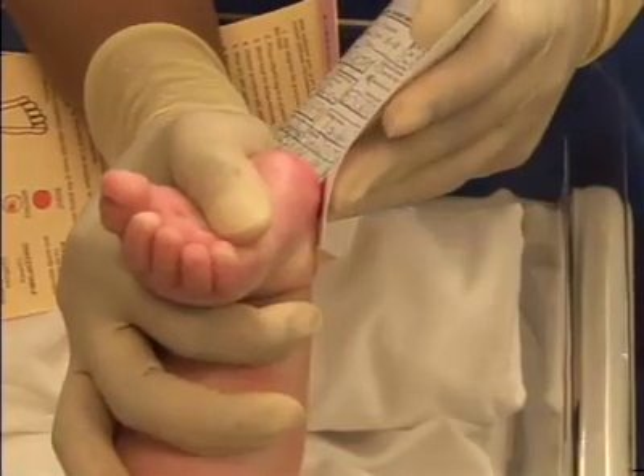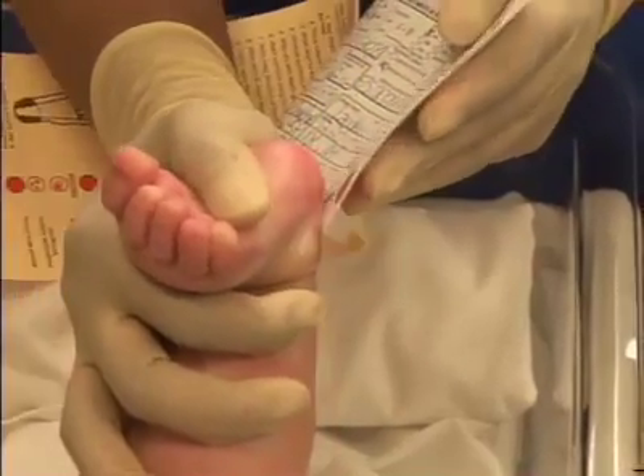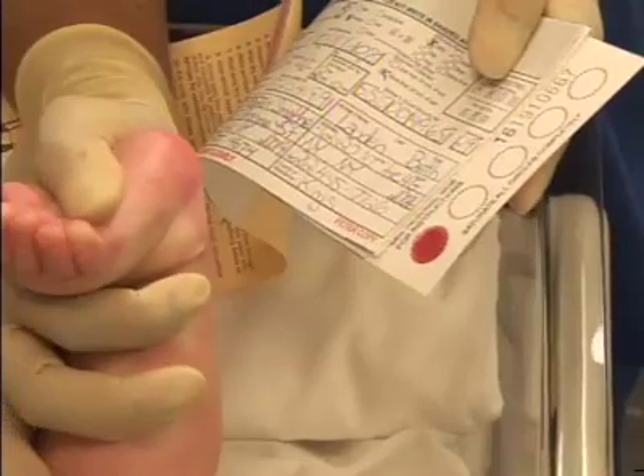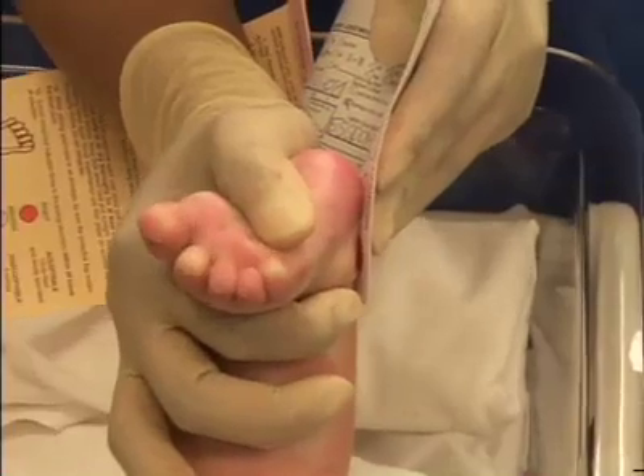Perform the skin puncture according to procedure and wipe away the first drop with a sterile gauze. Allow another large blood drop to form. Lightly touch the printed side of the filter paper with the blood drop and fill each printed circle. Allow the blood to soak through and completely fill the circle with a single application to the large blood drop. If the circle does not fill entirely, wipe the heel and express another larger drop to a different circle. Remember, do not add a second drop of blood to a previously used circle. Also, the filter paper must not touch the skin puncture site and only one side of the filter paper should be used.